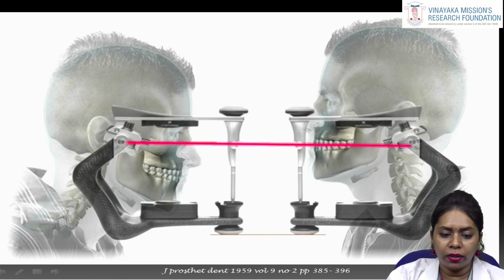Regardless of the movement that the dental articulator is capable of replicating, the models must be positioned using a FACEBOW so as to allow us to replicate the position of the maxilla, which is necessary to allow the articulator to subsequently perform the correct movements. Blind orientation of maxillary cast on the articulator may result in errors, so slight that the FACEBOW transfer may appear unnecessary in complete denture fabrication.